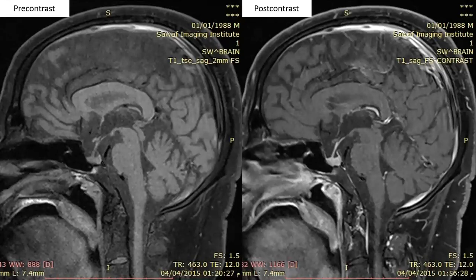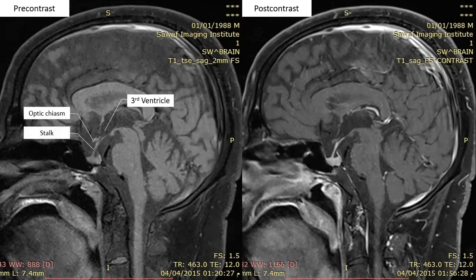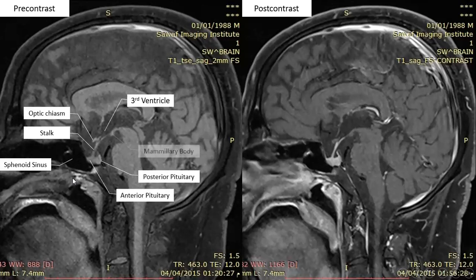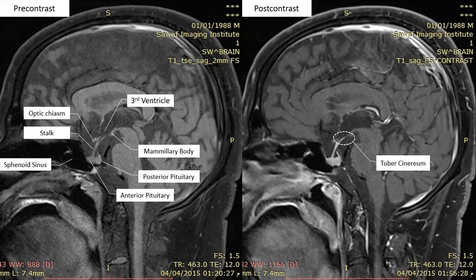This is a sagittal image for the same patient, also pre- and post-contrast. This is the third ventricle, the optic chiasm, the pituitary stalk, the anterior pituitary, and just posterior to it, the posterior pituitary — seen as a bright line posterior to the anterior pituitary. Another important component is the sphenoid sinus, which is the entrance for trans-sphenoidal surgeries, the most common approach for pituitary tumors. The mammillary body is also important, and the tuber cinereum — the area between the pituitary stalk and the mammillary body — is a very important site for lesions in precocious puberty.